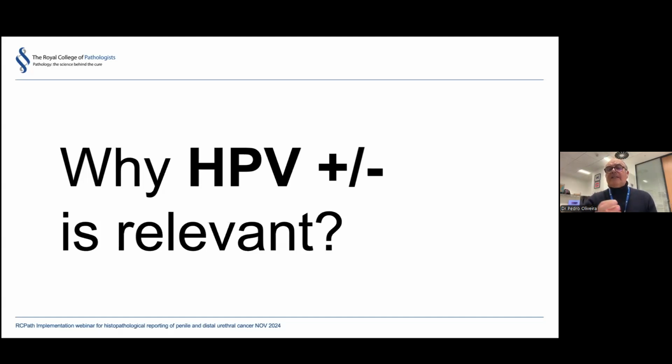What we know so far is that the historical data has been mixing cases with HPV positive and HPV negative, because a large proportion of cases which don't show the morphological characteristics that we were used to calling associated with HPV, that means cases which didn't show the usual type squamous cell carcinoma, we know by immunohistochemistry that a considerable proportion shows HPV integration and shows staining for P16.